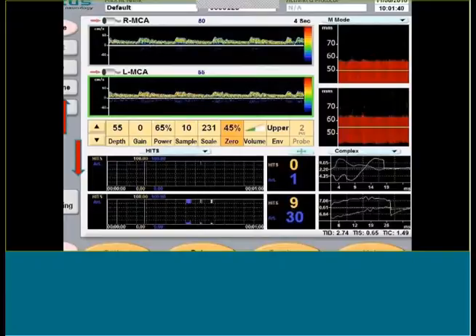So this here is complex. I don't really put a whole lot of faith in this. It's just a drop-down menu that you can change for like energy distribution. I don't use it that much. I don't put a lot of credibility in it.